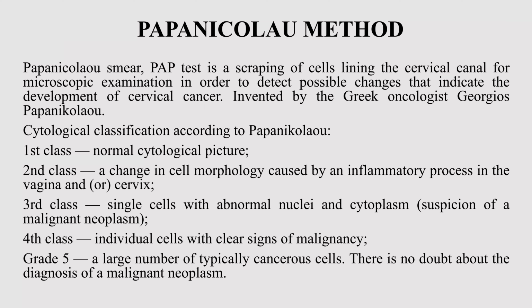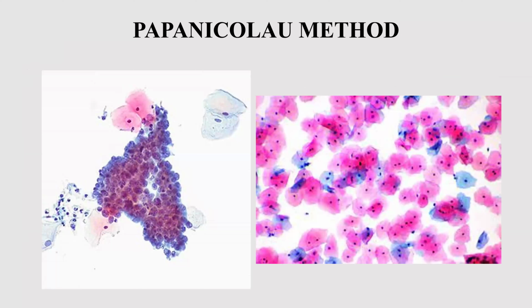It's probably as I'm trying to explain in simple words, but it's better for understanding. This is a typical Papanicolaou staining, smears from the gynecology tract. You can see different coloring with different epithelial cells and some cell lining from the cervix, etc.